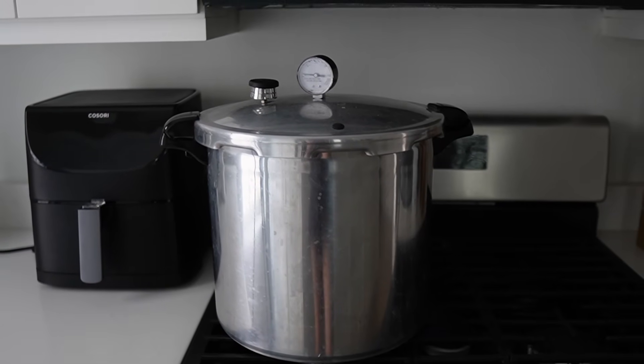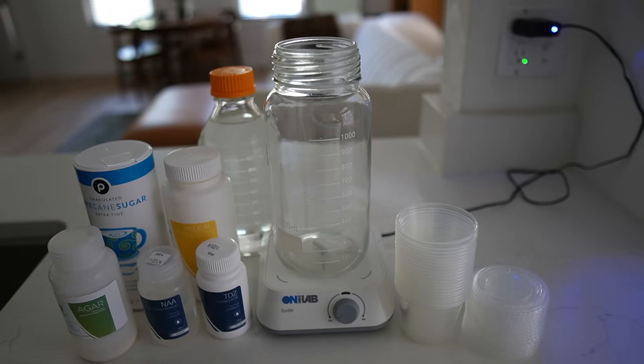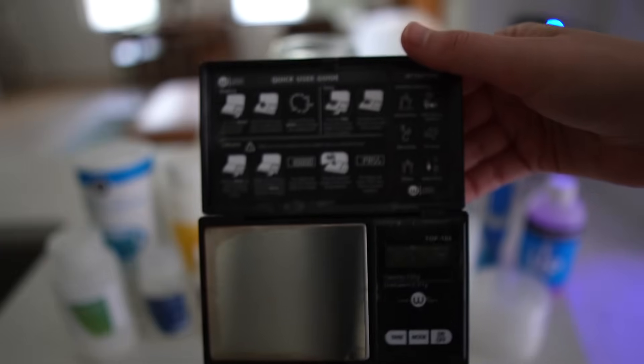For the no-pour method we are going to need a large pressure cooker — an Instapot works too — a cheap magnetic stirrer, some autoclavable polypropylene containers, the ingredients to make the media, a pH probe and hydroponic up or sodium hydroxide, a micropipette for dispensing liquids, and lastly a scale.